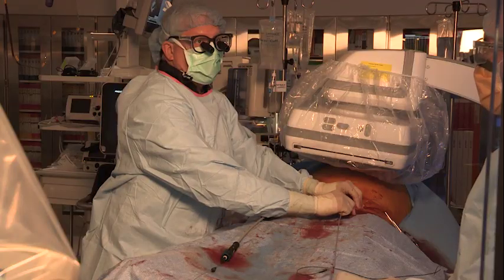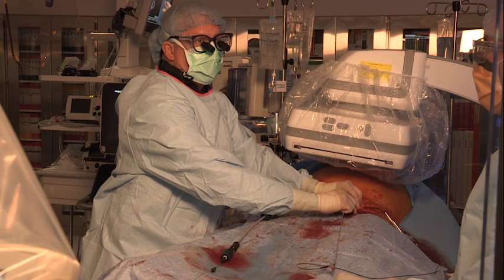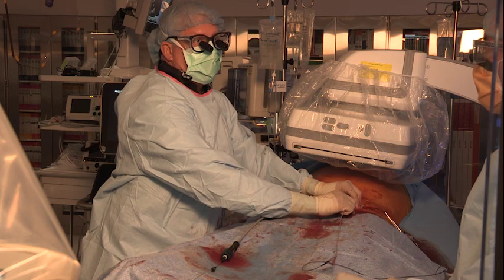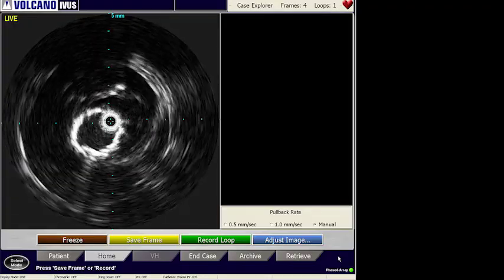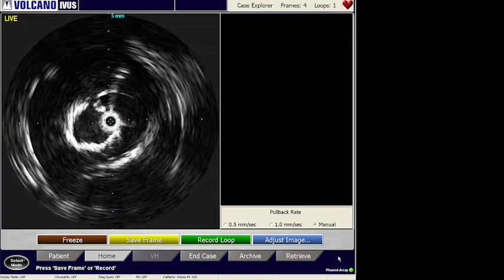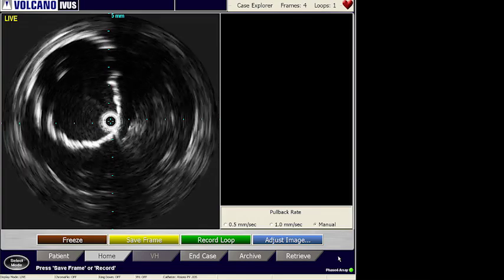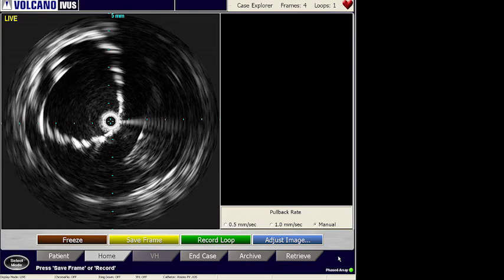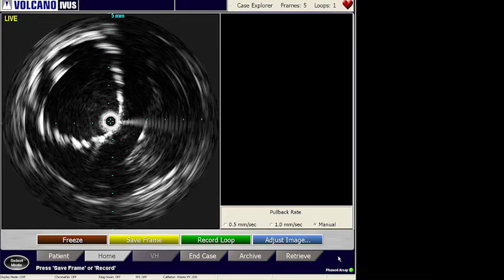Confirmation of gate cannulation is paramount, as the docking limb will be placed over the contralateral wire and overlapped into the main body graft. The most commonly used method to determine correct wire placement is spinning the pigtail, followed by the snowman technique or a graftogram. However, these techniques are often not definitive.